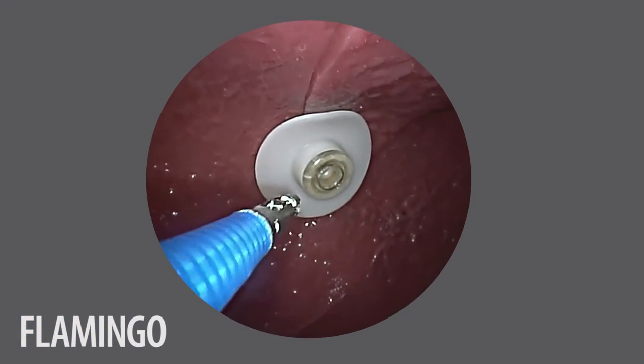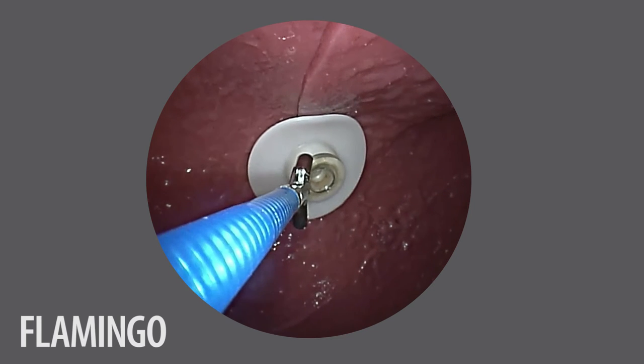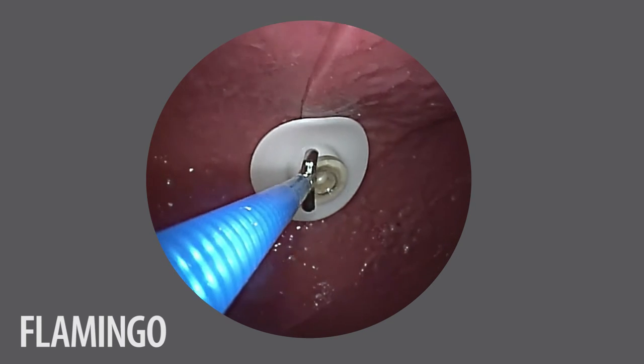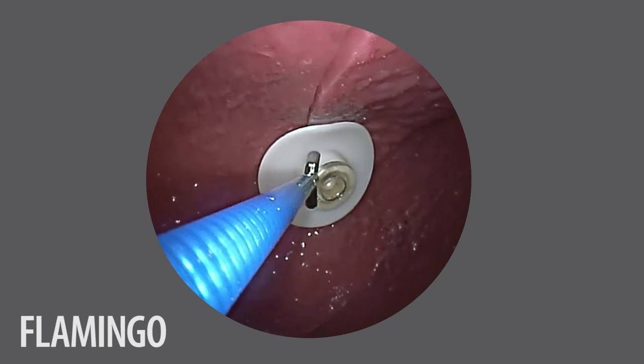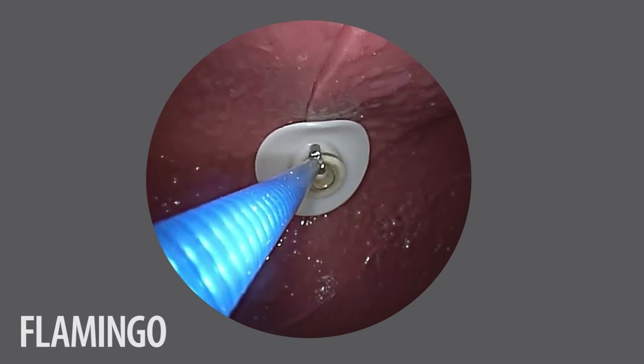Now, insert the forceps for foreign body removal into the stomach via the endoscope. Grasp the transparent ring of the retaining plate and remove the peg probe.